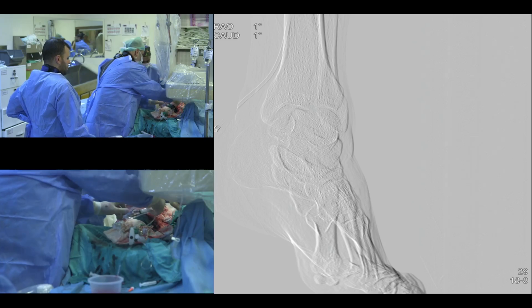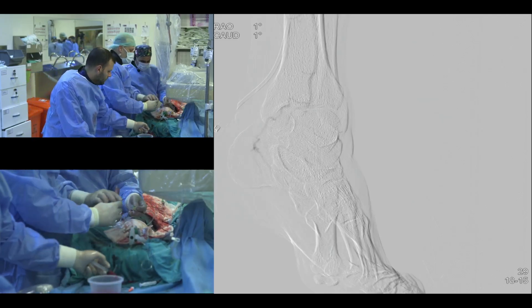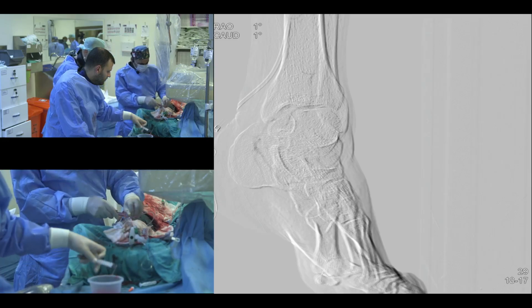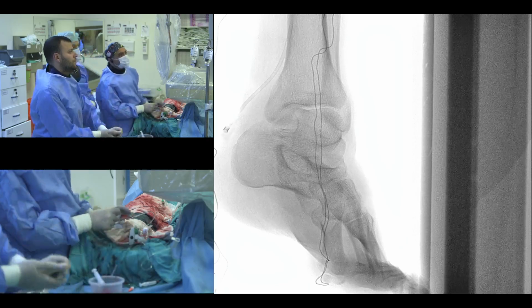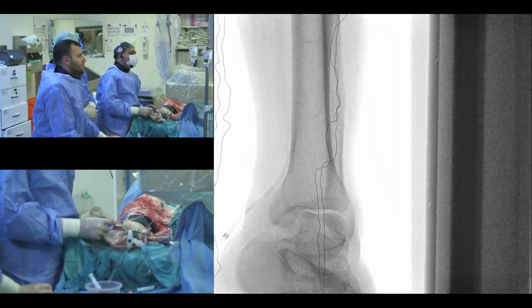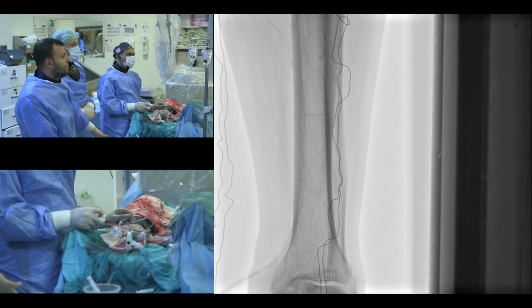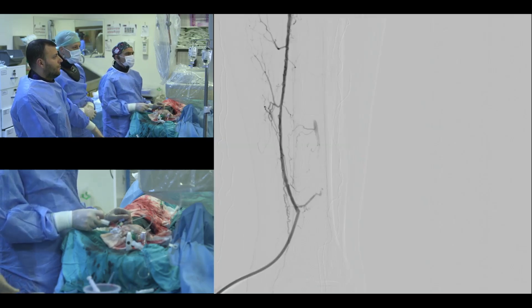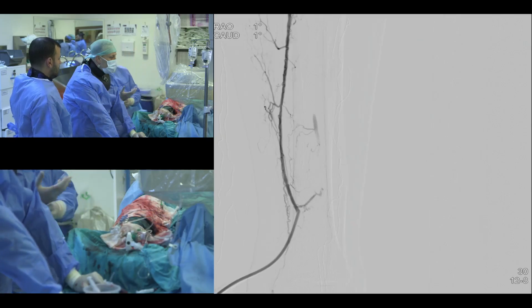Now, if you have a 100% occlusion, you have to cross it. So again, as I explained, we use a Viance catheter, which you see in the picture on the left side. You can use wire escalation techniques like coronary CTOs, and then you can use Quick-Cross angled catheters. These are very supportive catheters that you can push through the blockages, and they're pretty safe. Whatever choice wires you like, you can use those stiff wires. Do not use a re-entry device because these vessels are only 2 to 3 millimeters in diameter, so the Pioneer does not work there.